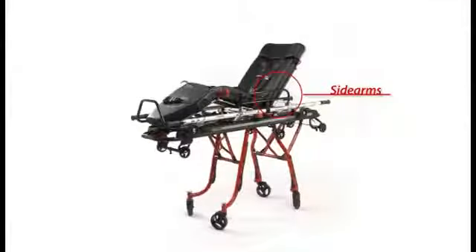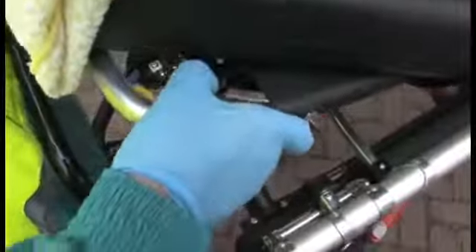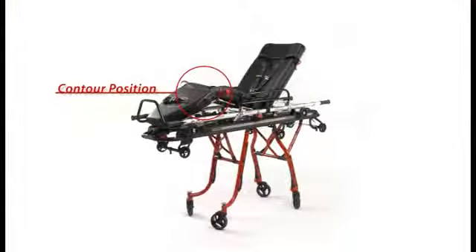To lower the side arms, pull out on the red knob and rotate the side arms down. To raise the side arms, lift up on the side arm until the red knob locks into place. When required by protocols, engage the shock position by lifting up on the end of the foot panel until it locks into place. To lower the foot panel, lift up slightly, press the foot end tabs, and lower the foot panel. For patient comfort on long transports, engage the contour position.